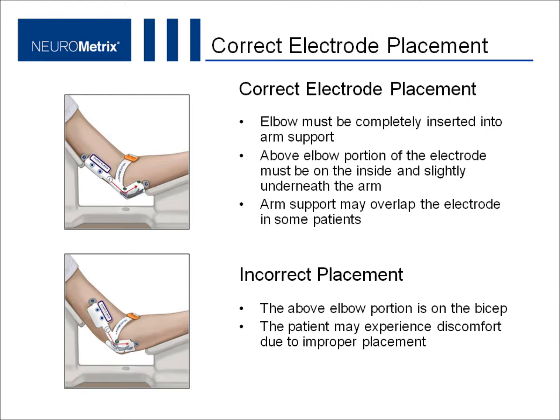Please check to make sure the electrode is placed correctly. Ensure that the patient's elbow is correctly positioned in the arm support. The above-elbow portion of the electrode must be on the inside and slightly underneath the arm. The arm support may overlap the electrode. The electrode is incorrectly placed if the above-elbow portion is on the bicep — this will result in a poor signal and the patient may experience discomfort.